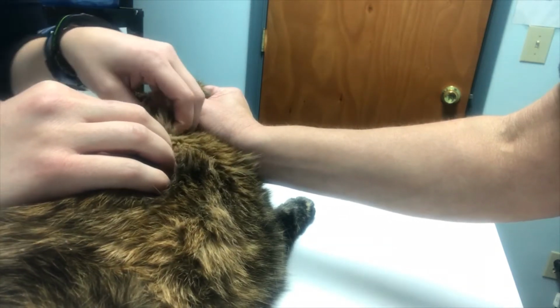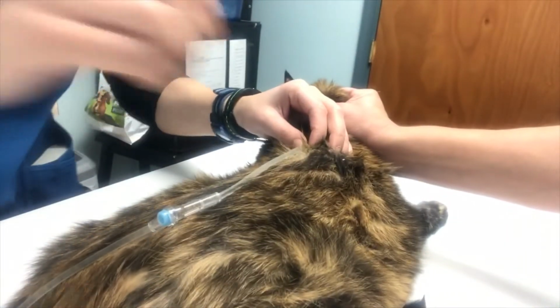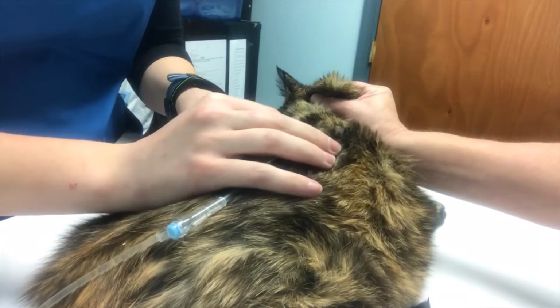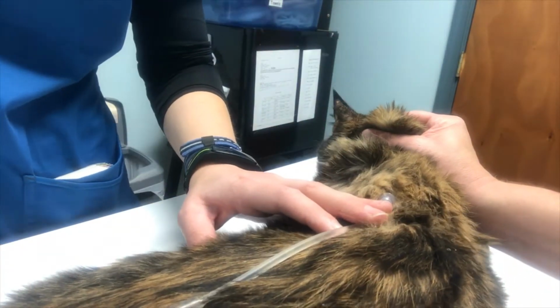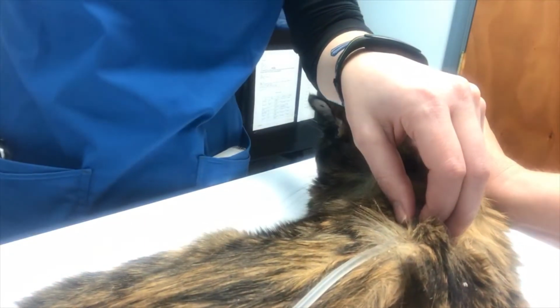All right, now they're flowing. Can kind of watch our gauge here so you can see that the flow, it's a good flow, steady flow. As it's going in, it will make a pocket and make a bubble. She's only getting 100 milliliters of fluids, but you can kind of gently rub the area to help disperse the fluids as it goes in. Target of 100 mLs now.